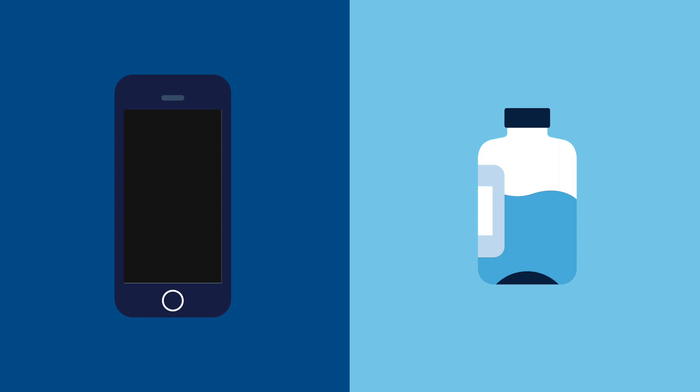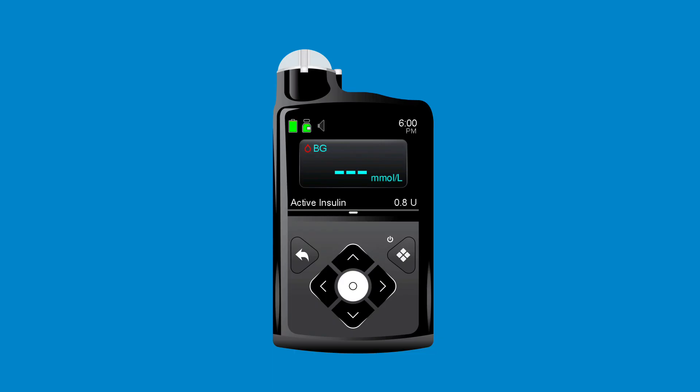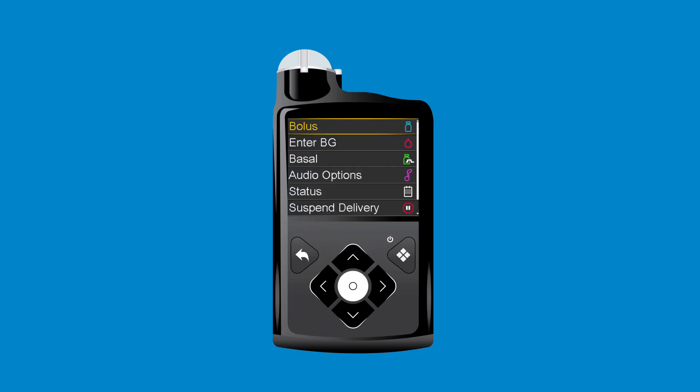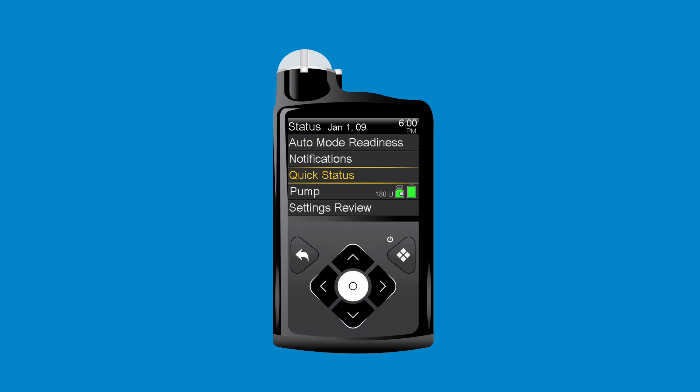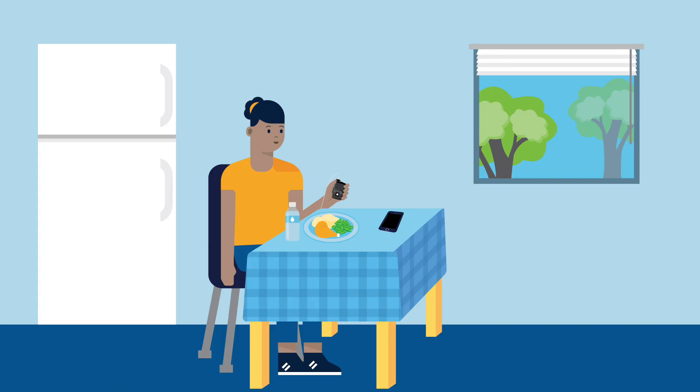Anna ends her call and forgot how much of the bolus was delivered. She needs to deliver the rest of her bolus for dinner. Anna checks the Quick Status screen to see how much insulin she received. She opens the main menu, selects Status, and scrolls down to Quick Status and presses Select. Here, Anna can see the time and amount of the last bolus she delivered. Anna programs and delivers the rest of the bolus before she begins to eat.